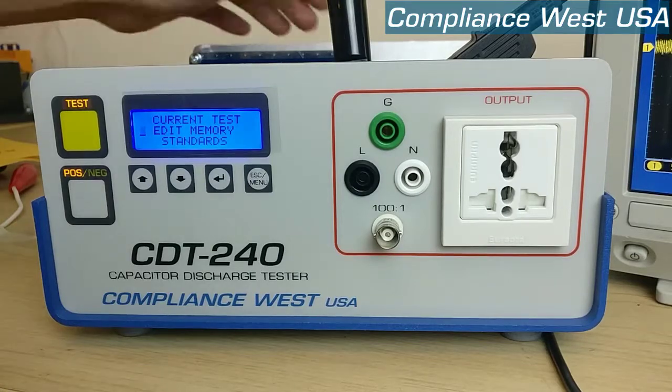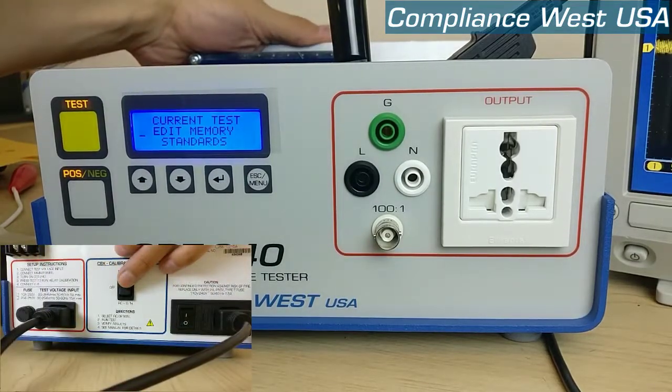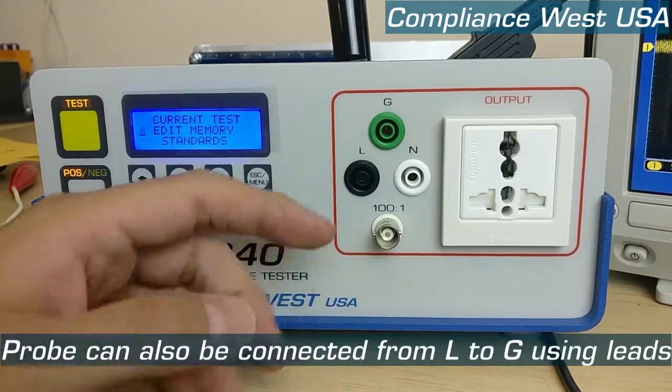Also make sure that the switch on the back of the CDT is on the 1 second position and we need to connect a probe between line and ground.